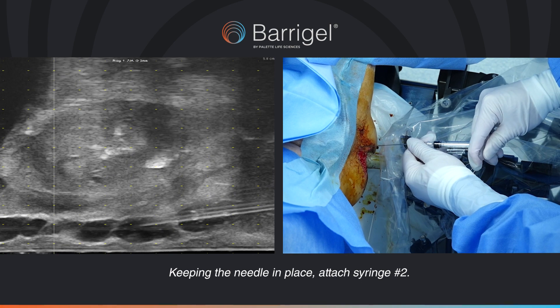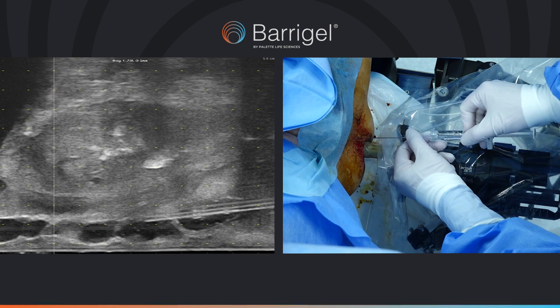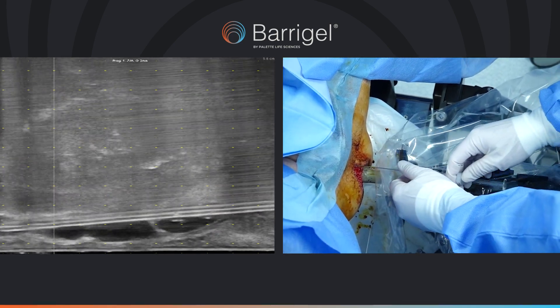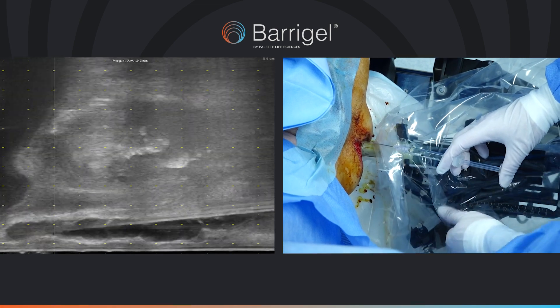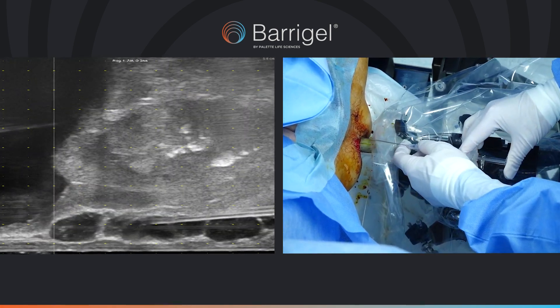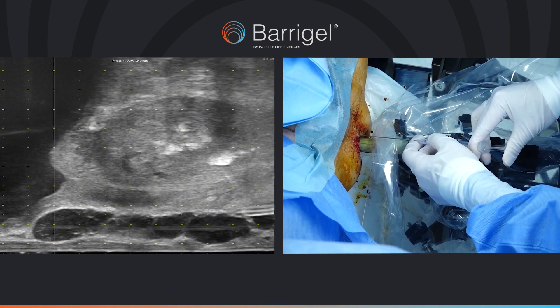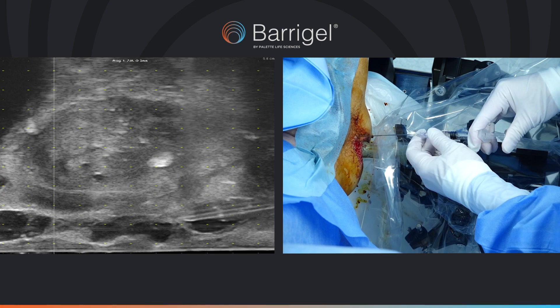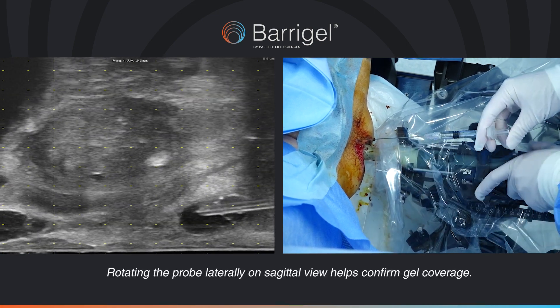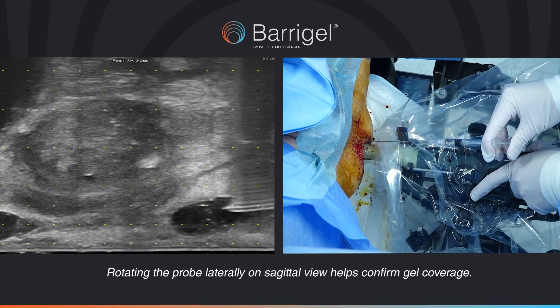Keeping the needle in place, attach syringe number 2. Rotating the probe laterally on sagittal helps confirm gel coverage.